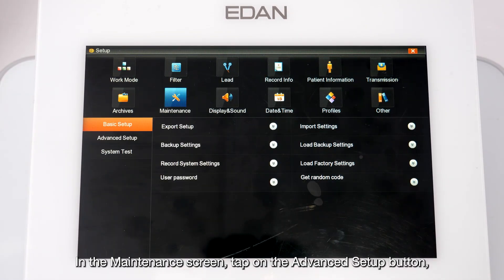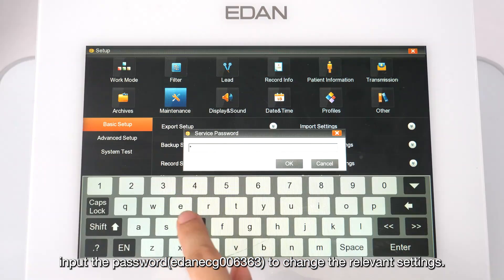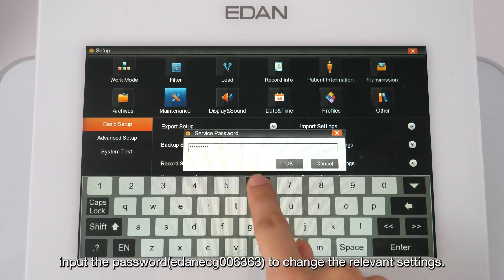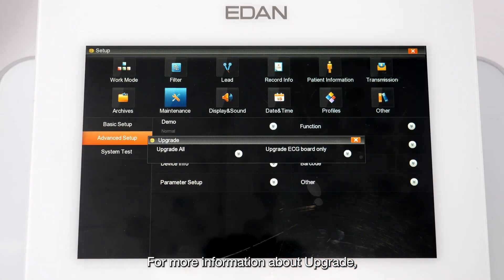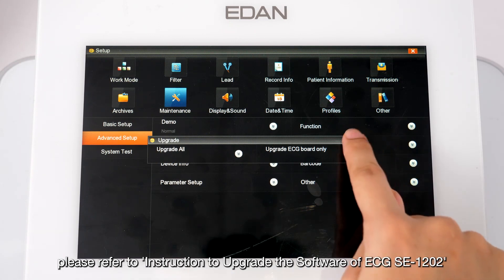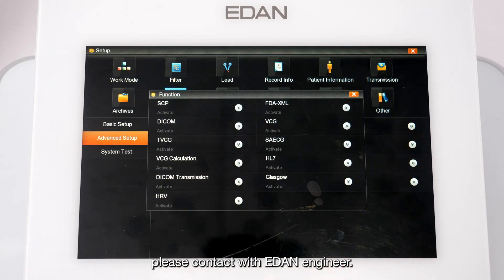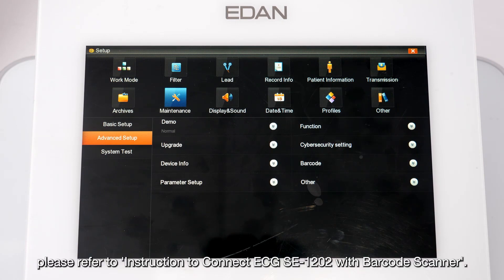In the Maintenance screen, tap Advanced Setup and input the password to change relevant settings. For more information about upgrading, please refer to the instruction to upgrade the software of ECG SE-1202. To activate advanced functions, please contact an Eden engineer. For more information about barcode settings, please refer to the instruction to connect the ECG SE-1202 with a barcode scanner.